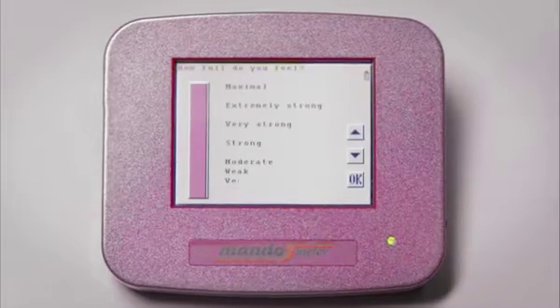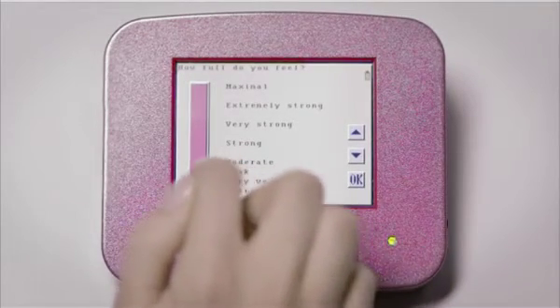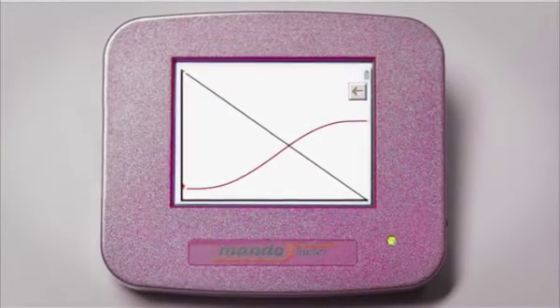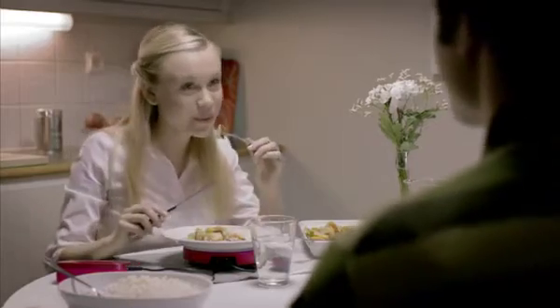Before you start eating, you indicate how full you feel on the screen. You estimate how full you feel several times during the meal. Mandometer tracks how full you feel relative to a normal satiety rate.